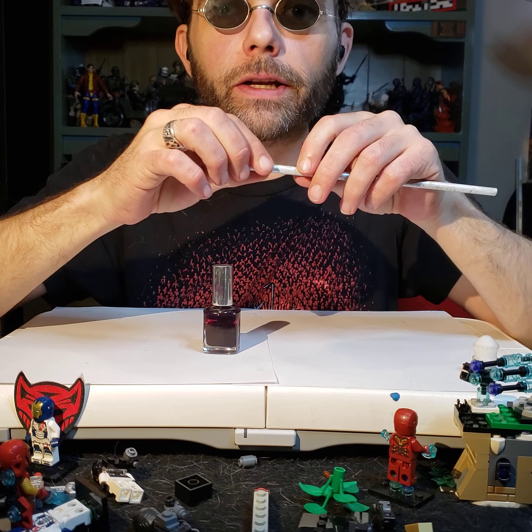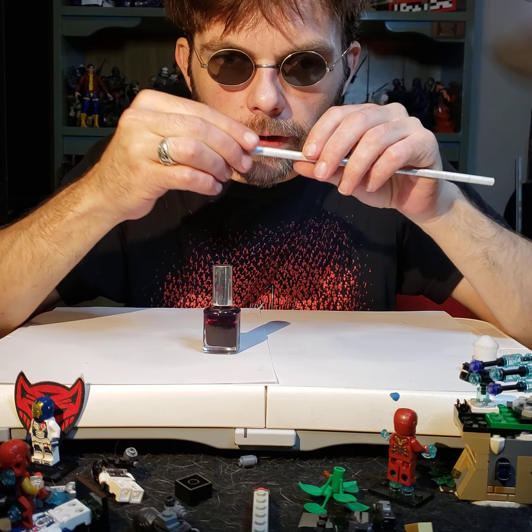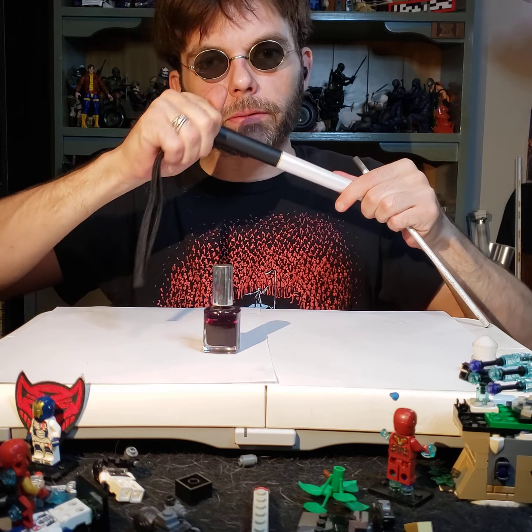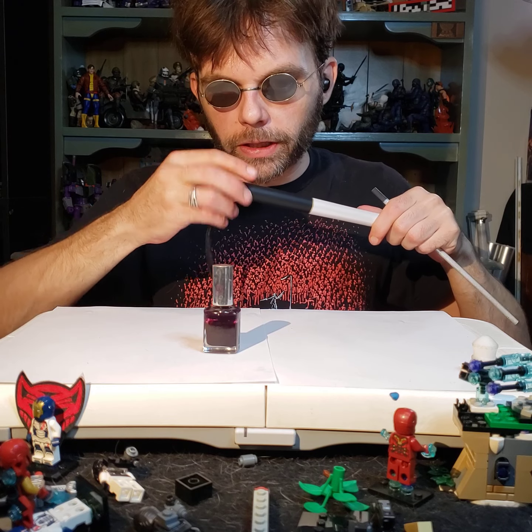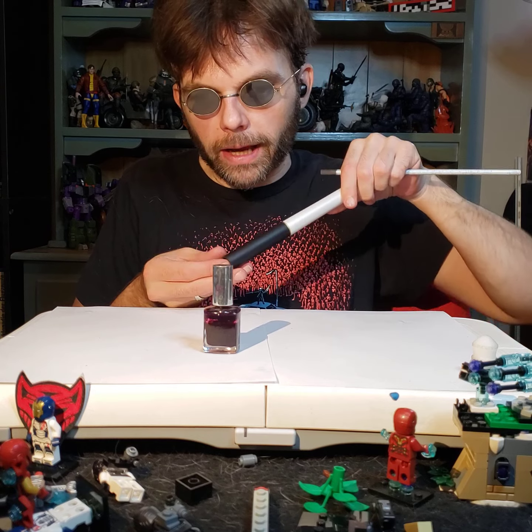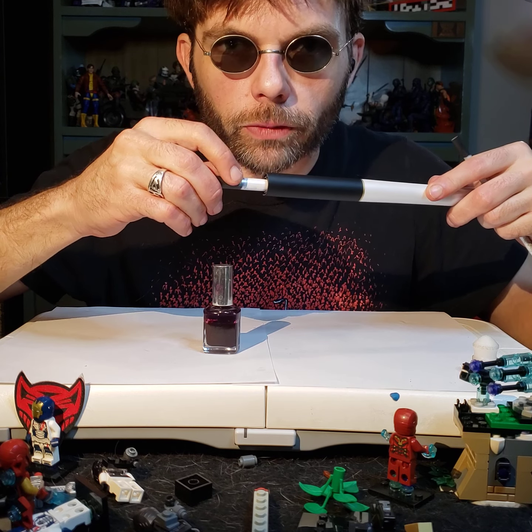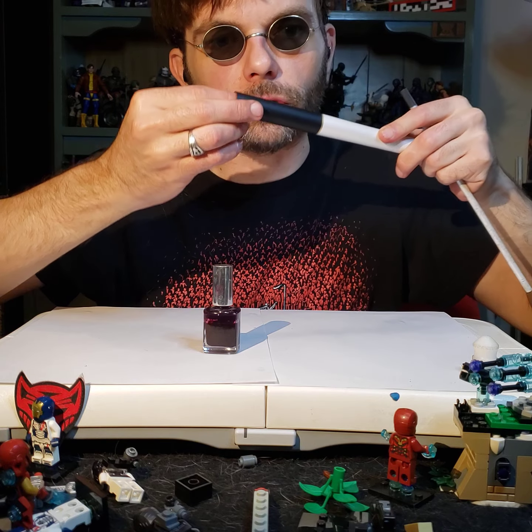Now, if you feel on the end of your blind cane, if the tip falls out, you'll notice that this is very, very smooth. Now, before we get into it too much, let me open the end of this guy up and pull out one of the ends to give you an example of what it's supposed to look like. Because it's not supposed to be as smooth as glass. It's supposed to be rough. See, this is rough. It's a very rough texture because this texture is supposed to grip. The cane uses the texture at the end of each one of these little tubes to grip.